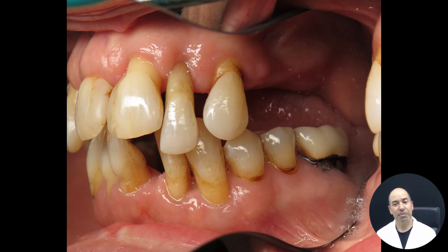So the plan is going to be under IV sedation in the office. I'm going to start an IV in her arm, give her some medications, make you sleepy, comfortable, and over the course of a few hours, take out all the teeth and put in the implants.